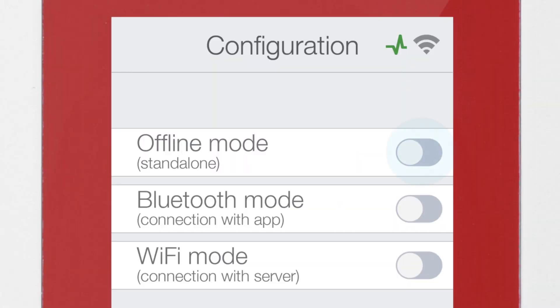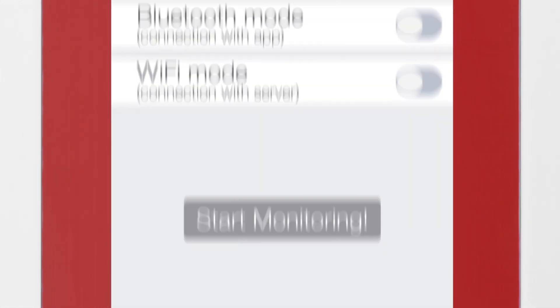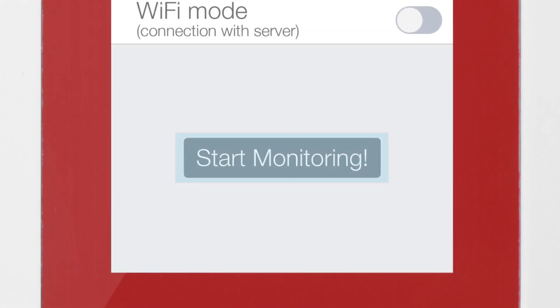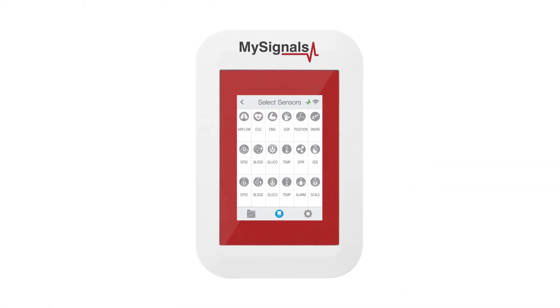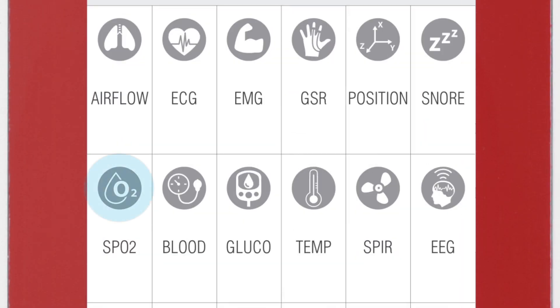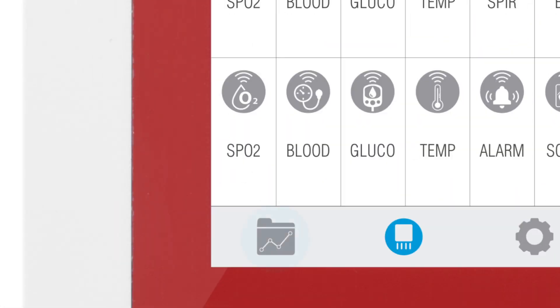Select offline mode in the menu and click on the start monitoring button. In the sensor selection screen, you can see all the sensors available. By selecting the SPO2 sensor, the icon will turn blue. Then click on the data button to access the data screen and start visualizing the data.